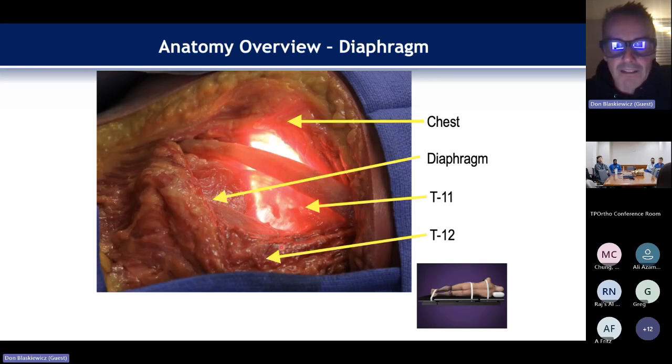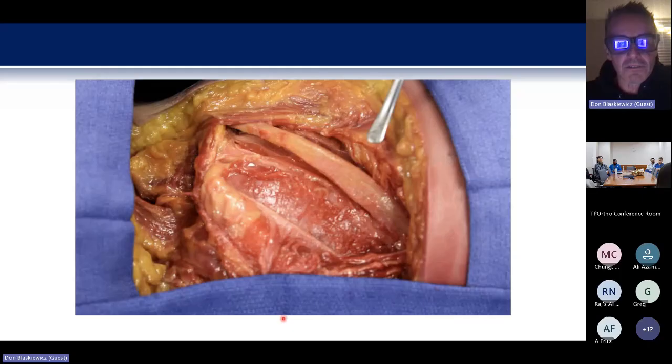That's a diaphragmatic attachment. And you can actually release that and push that up, as I said earlier, my new favorite technique to do. And again, I don't think this video is going to play, but this was basically moving this rib over and then looking at where the diaphragm exists in here. It's really thin, so it's not like it's a huge thick muscle that you can see unless you're an avid cyclist who goes up Del Dios Highway every day like Greg.